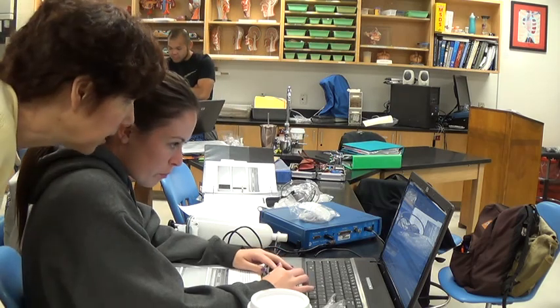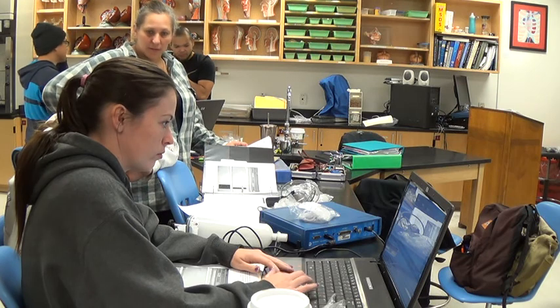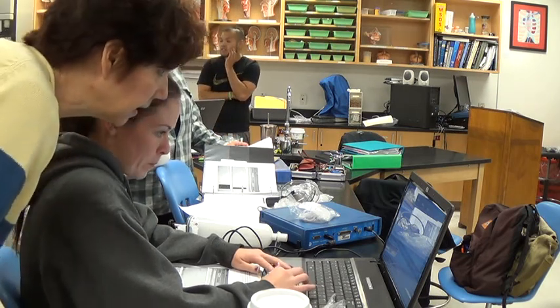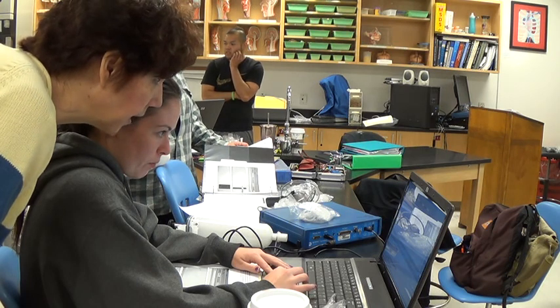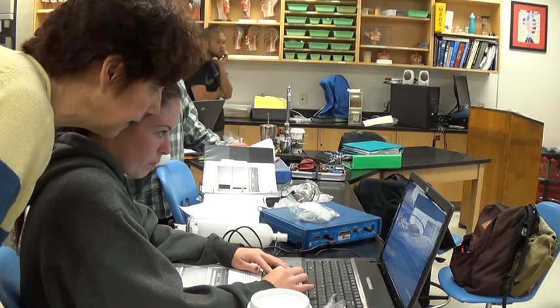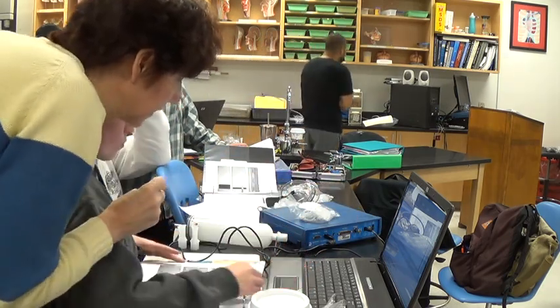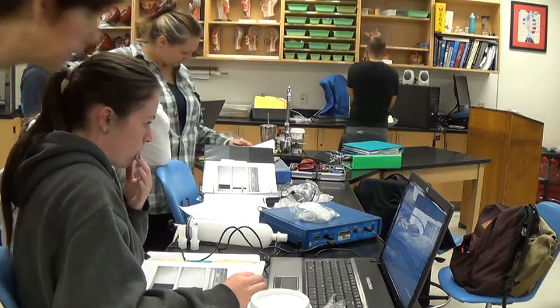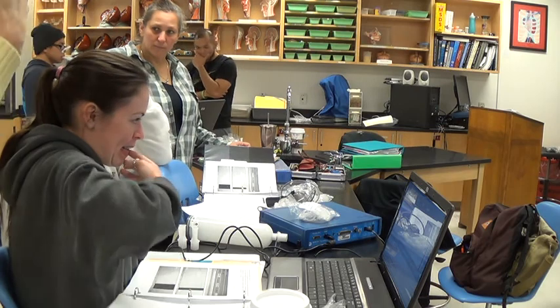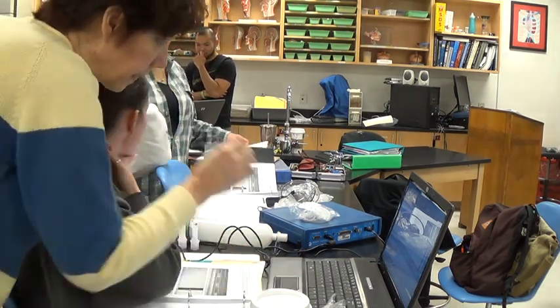Yeah. You want to go through the full thing, but you need to go to delta T for a second. Oh, up there, okay. Top to bottom. So it should go to as close to 1 second as you can. That's fine. All right, so then you read PP, and that's 2.28. Milliliters, right? Yeah, it's fine if you're at 2,280, whatever. All right, so write that number down.